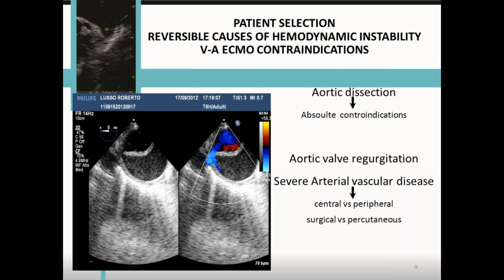A worsening MR means it is the impending ACS coming up. It is the beginning of an infarction. Your LV is not good. Aortic valve closing, as Vivek told you, is one of the worst signs. Aortic valve closing tells you what? It means that your LV is not pumping out. Yes, so LV stunning and stasis and thrombus formation will happen. And this is your patient requiring an urgent LV venting. So this is how echo helps you.